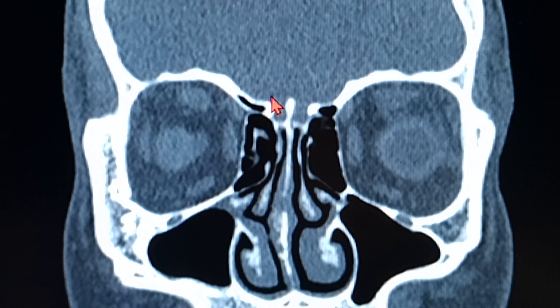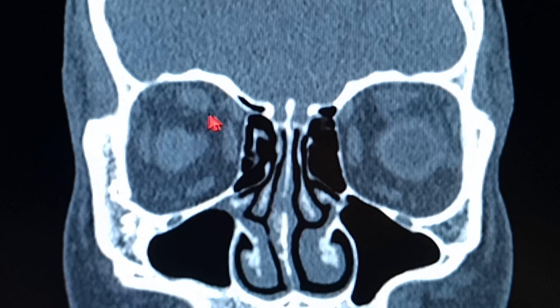That's the skull base. That's the brain tissue over here. That's the skull base. You can see a very small area of pneumatization over here. That's still the area of the superior-most intranasal cavity. So if there is some collection over here, ethmoidal polyposis, you come to this area, you may not even know that the artery is there, and you end up injuring the artery, and that causes intraorbital hematoma, or you can say sudden blindness if not drained, or a lateral canthotomy is not done.